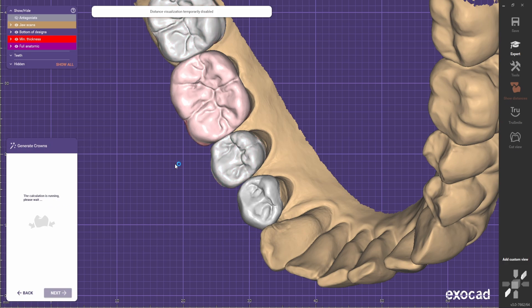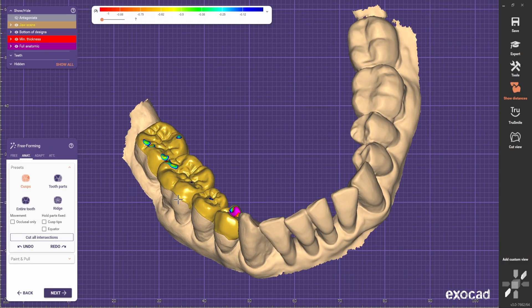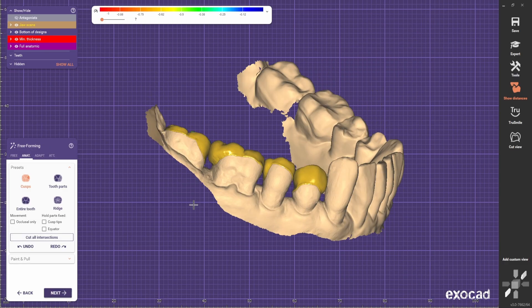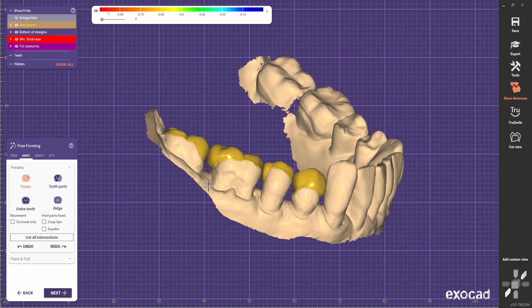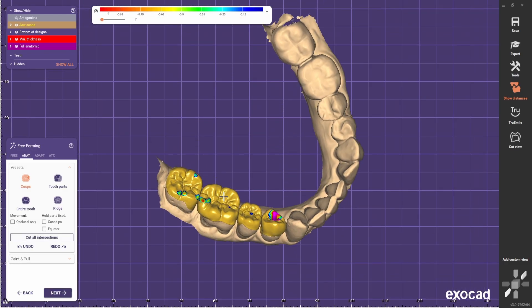Once you're happy with it, just go Next, and now we start playing with shapes.